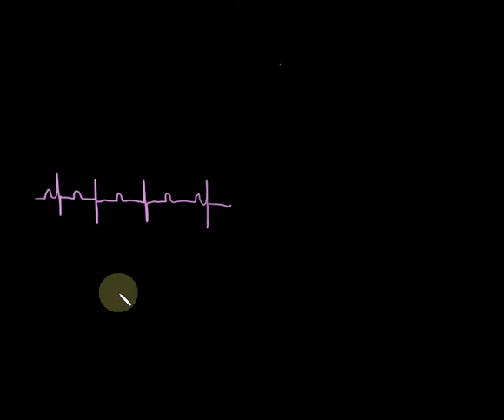I'm going to push you to say you have to confirm what you find through this short version, but the PR interval here is inconsistent. How about my R to R? Well, R to R, it's actually a little bit irregular, and I'll admit it is kind of sloppy. These three should be pretty much the same distance, and then there should be a pause where I've got this extra beat. And I'll show you some different examples when we go to the computer examples and the other rhythm examples. But essentially, the R to R is irregular.